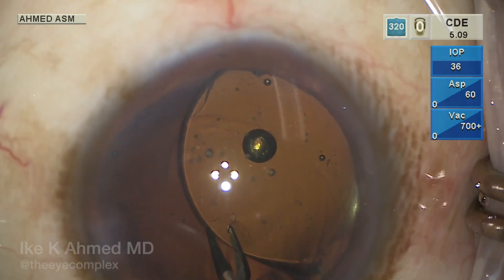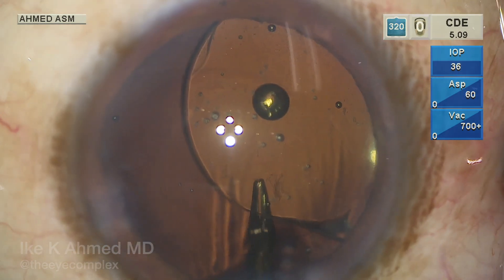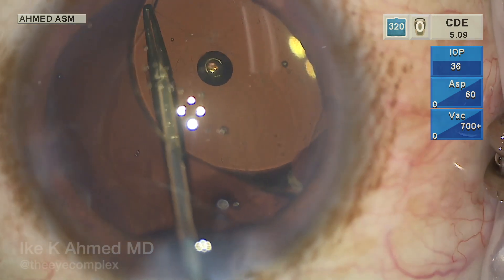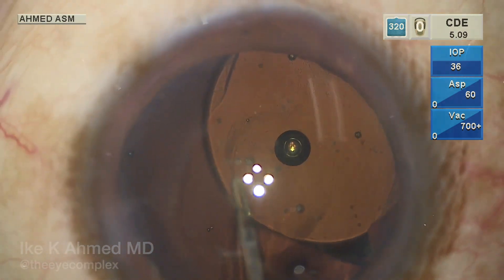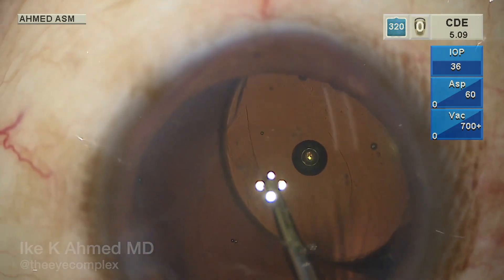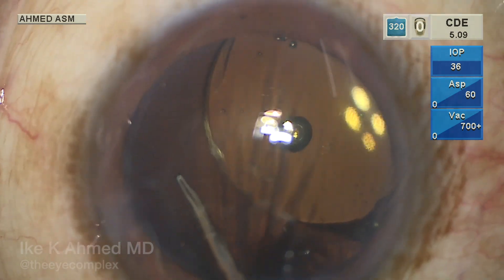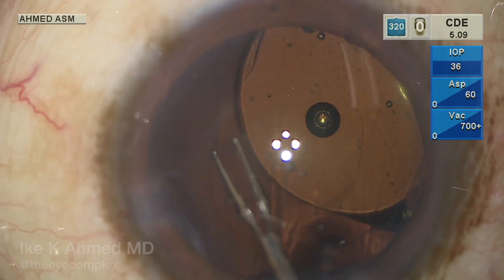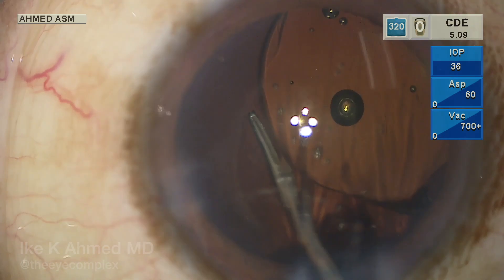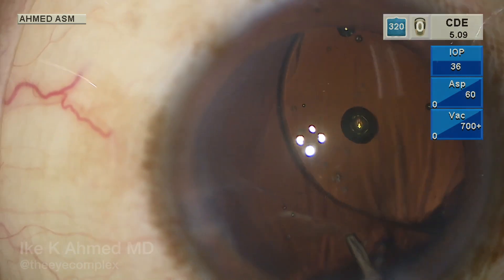A 27-gauge needle with viscoelastic, beveled down, is used to pierce through the central posterior capsule, which is very thin. Viscoelastic is injected into Berger's space to keep the vitreous back — just a little, not too much. A microforcep is then used to propagate the tear. The posterior capsule is fairly thin compared to the anterior capsule, but the principles of capsulorhexis are the same — using vector forces and shearing forces, folding the capsule over to create a continuous smooth tear. Frequent regrasps are helpful as control is somewhat less in this thinner capsule. A microforcep is helpful to work more posteriorly than typical for an anterior capsulorhexis.